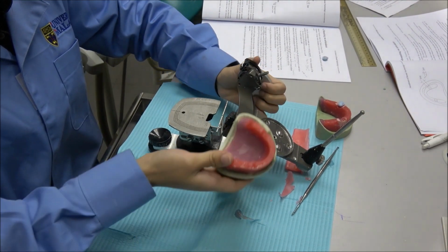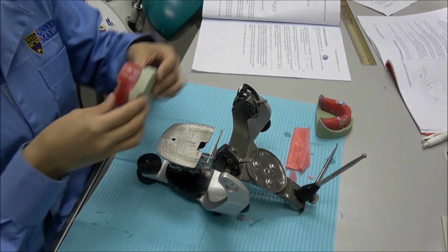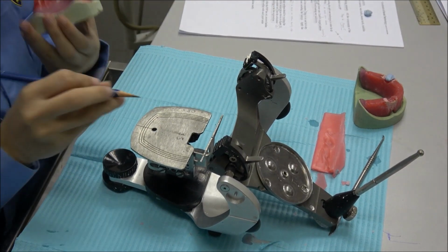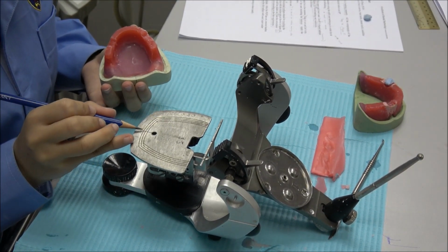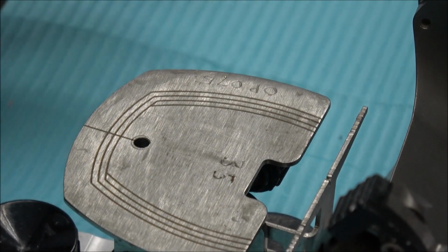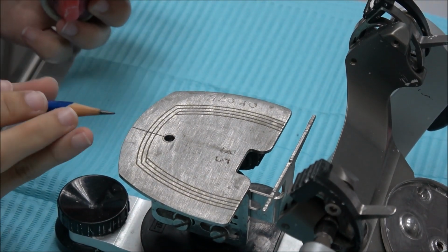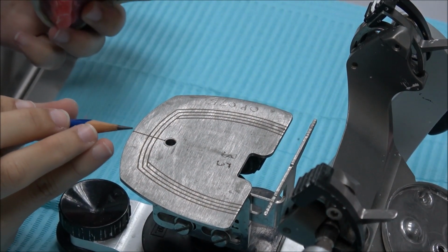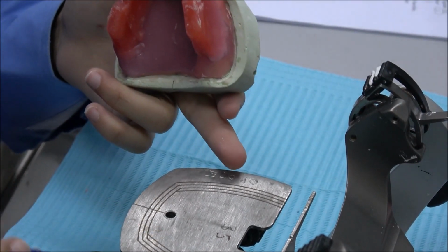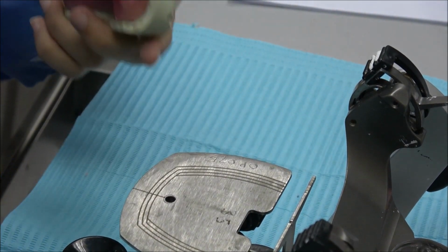Okay, we will place it, following the line we draw. Okay, first we will place it. Can you see there are 3 lines here? We follow the first outer line here, the first line. So our midline will sit on this line. This line is considered the midline. Okay, we sit here and then we put our bite rim, and we have to balance it. Make sure the bite rim is balanced, both following the line.